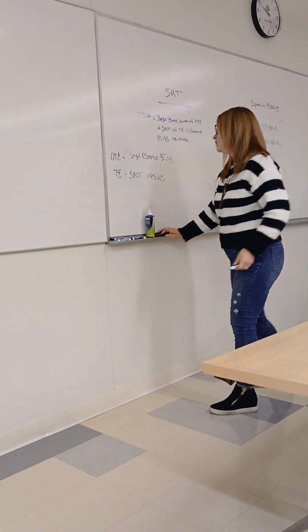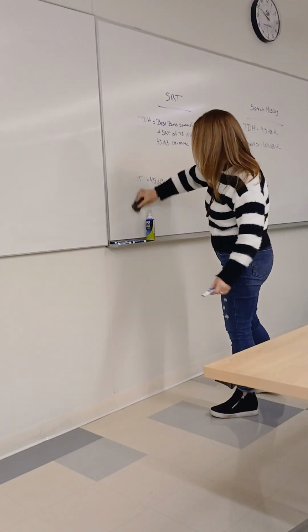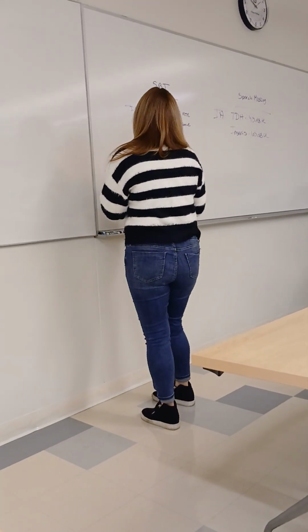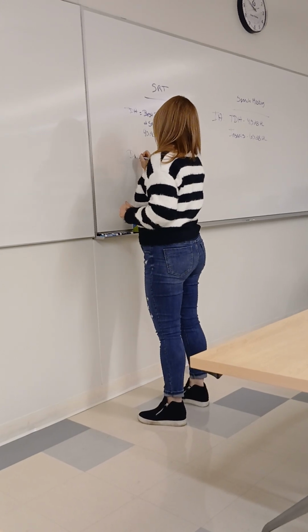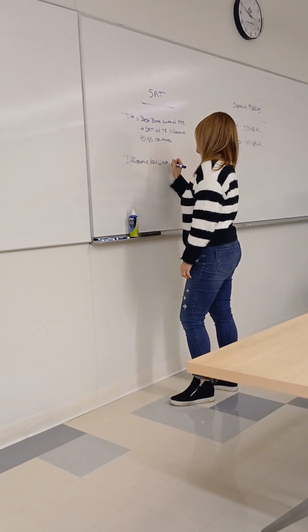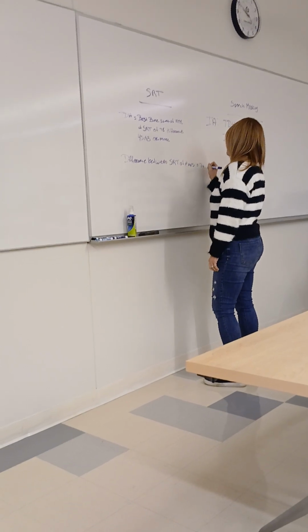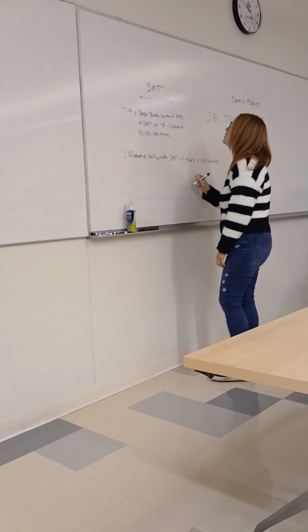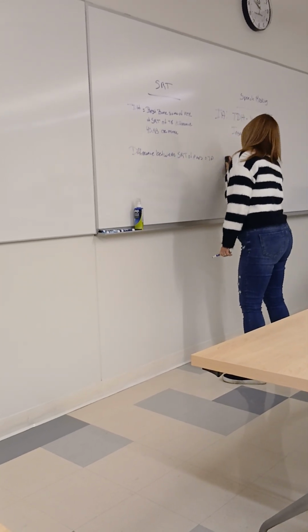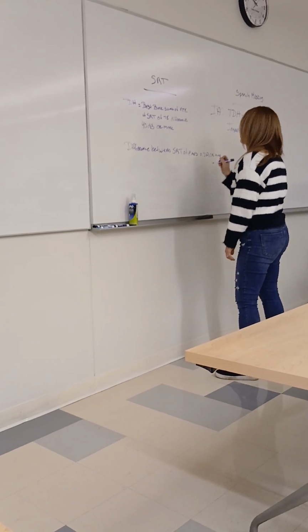So another, this is the one that I use on the very rare occasion that you have to do it. The other is difference between SRT of ears equals IA or more. I should probably make this actually look like 2 different words here. Or more.